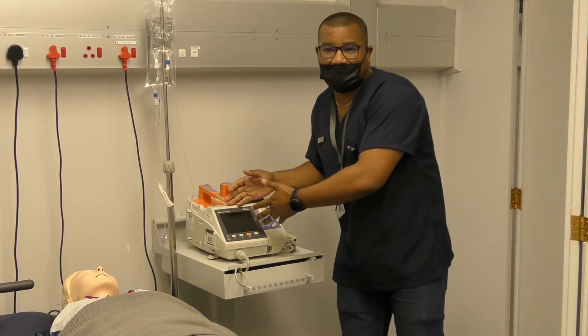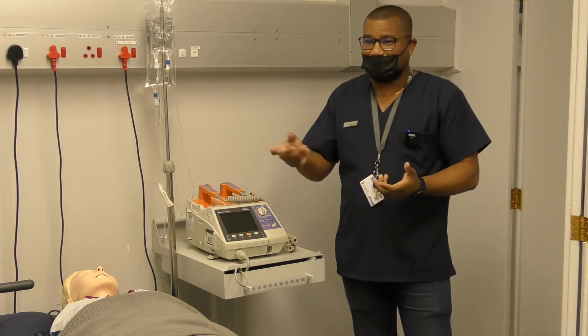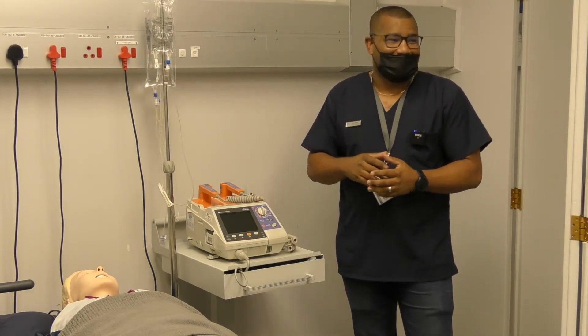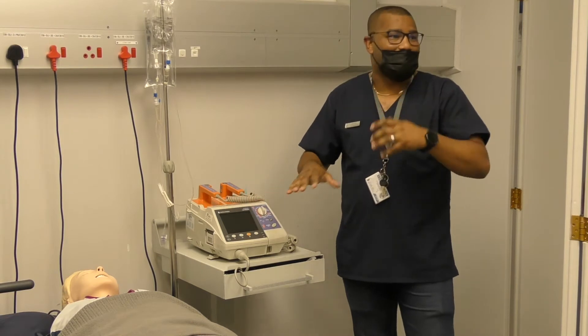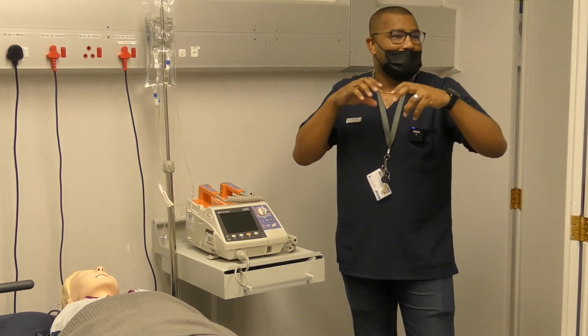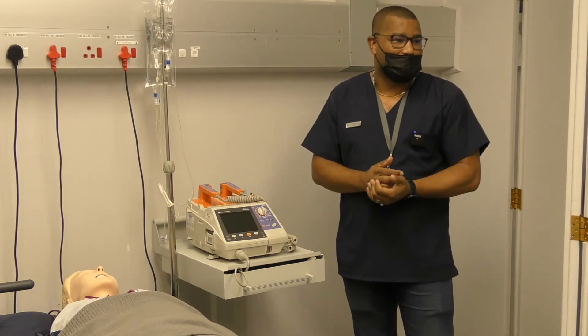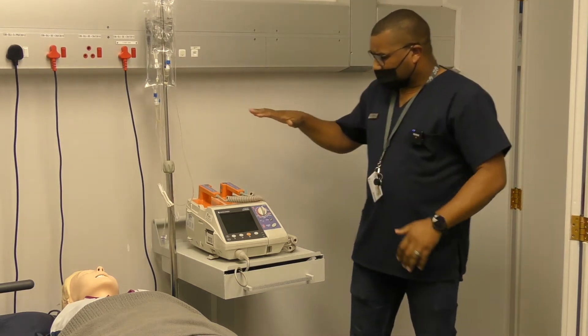You don't want to get to a point where you need to use this device and the battery is flat, especially now with the high incidence of Eskom load shedding. That's why these devices come with a battery as well, so that in cases where there's no electricity available, it can operate on its batteries.